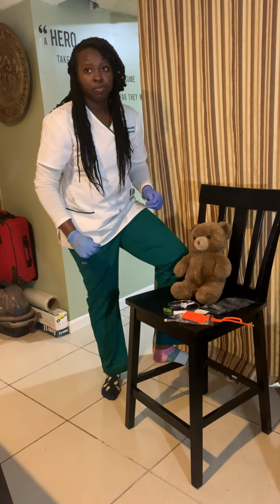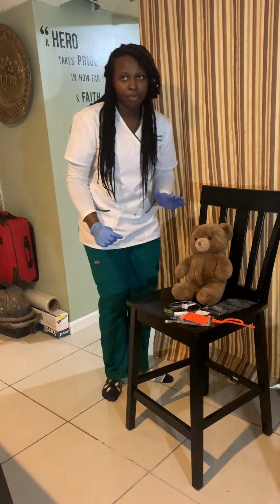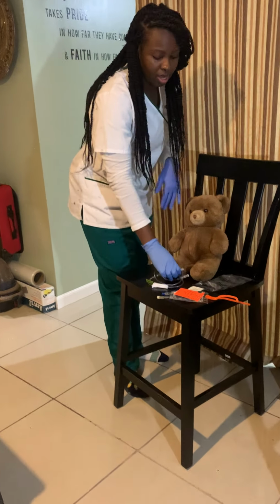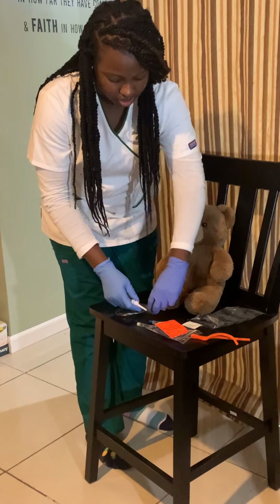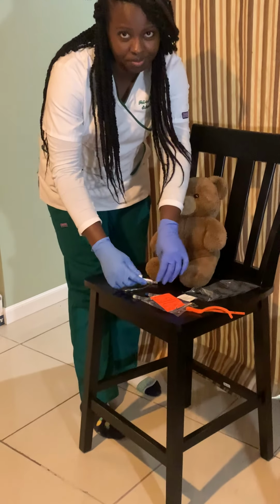I'm then going to remove the blue protective covering from the pouch, and I already cleaned it. And I'm going to attach the IV piggyback line to this. Now it's connected. I don't know if you guys can see that, but it is.